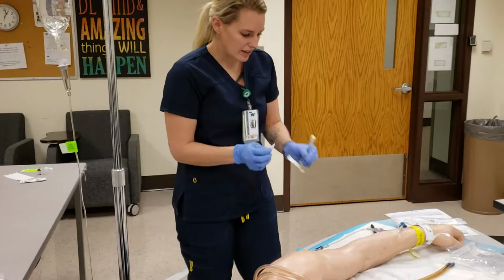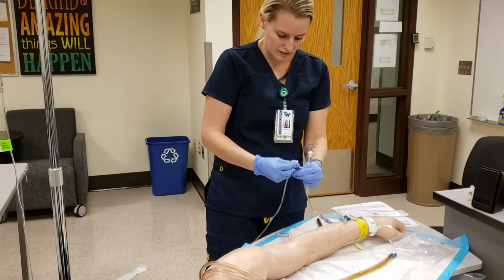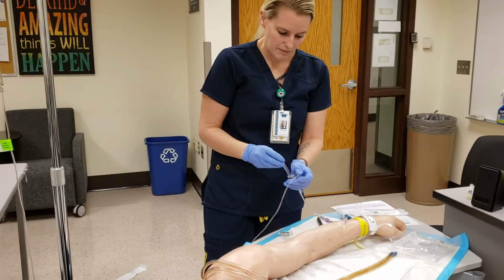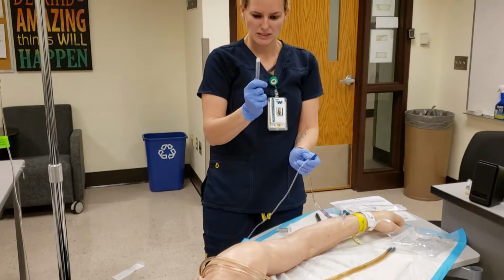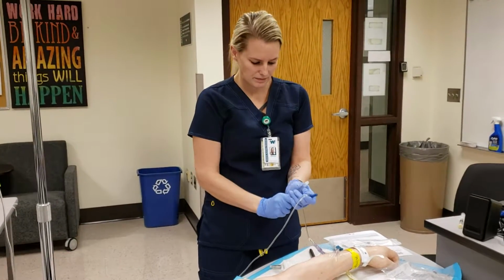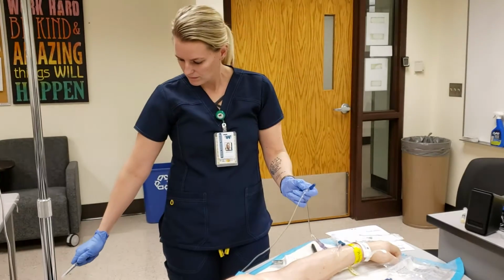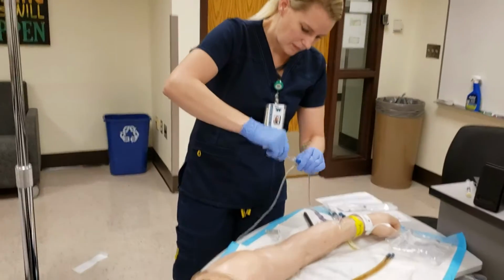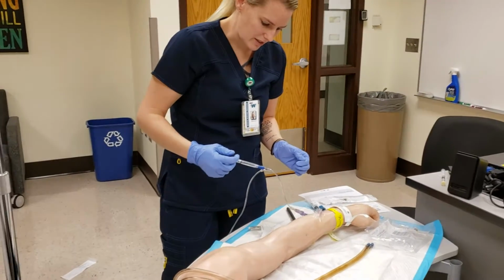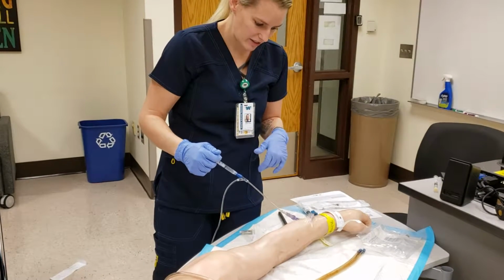So I've stopped the pump and I'm going to flush my IV line to make sure that it is patent. Get the remaining medication out.